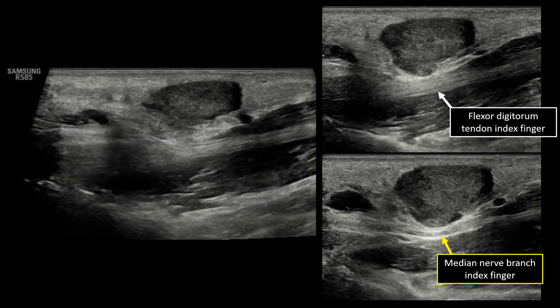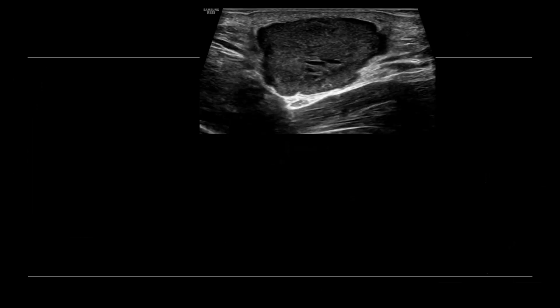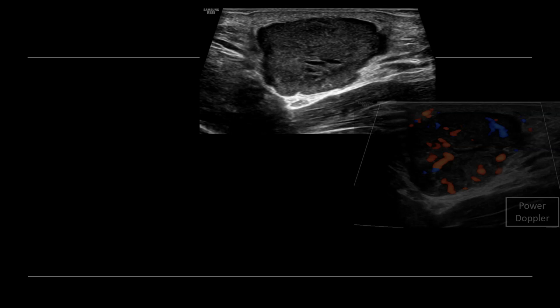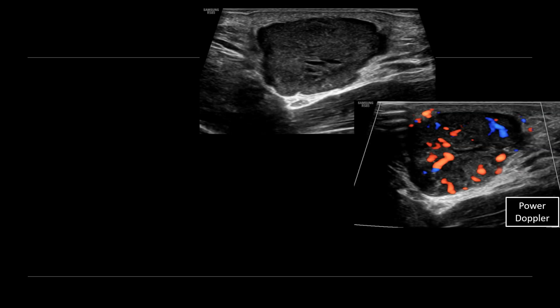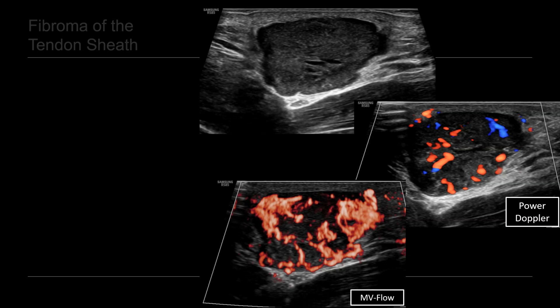There's also some mild mass effect against that median nerve branch. When we zoom in, we can see the lobular margins of this mass quite well. We want to evaluate again for internal vascularity. Here we're using directional power Doppler showing diffuse vascular flow, confirming that this is indeed a solid mass. And again, when we add MV flow, that microvascularity is really brought out. So even though this appears like another giant cell tumor of the tendon sheath, at surgery it was actually a fibroma of the tendon sheath.